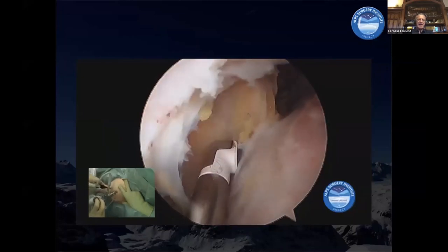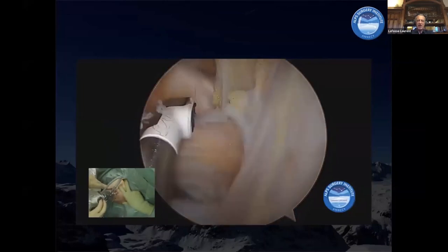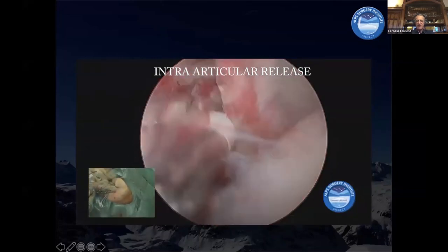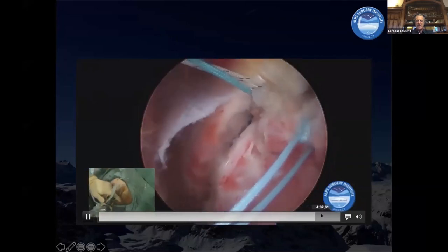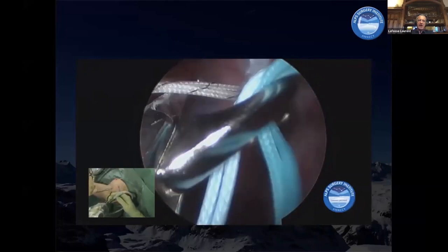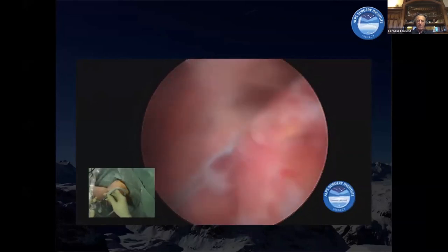I'm showing cases which are not the most common subscap cases, but sometimes you have to manage these because subscap retractions — very often traumatic cases in young people — lead to very high symptoms. It's important to release everything in order to repair. Once the release is complete, you go back, and at the end of the surgery you will see that we have passed every suture and managed to make a double row repair of the subscap together with the supraspinatus. You see this is a watertight shoulder, but we keep the rotator interval open — very important.